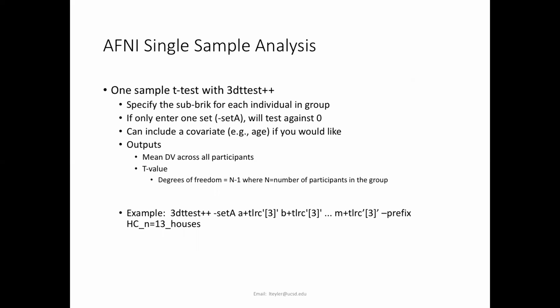But for now, I'm just going to be talking about how you get a value of the test statistic in every single voxel, and a little bit about effect sizes. Then you'll learn later about how to protect against all those false positives and get a sense of the most reliable finding from your group analysis.